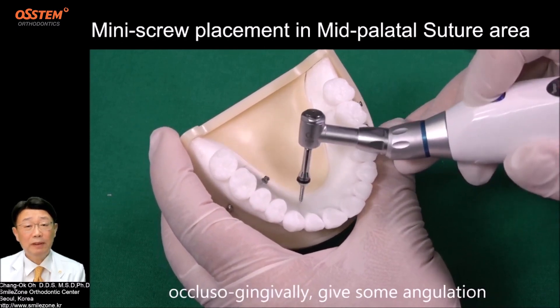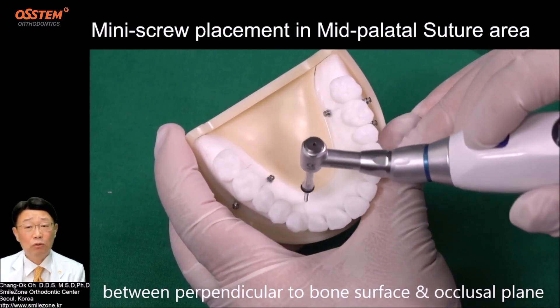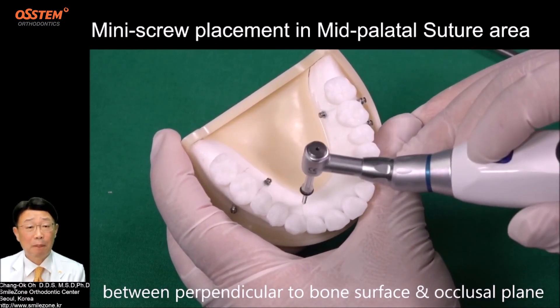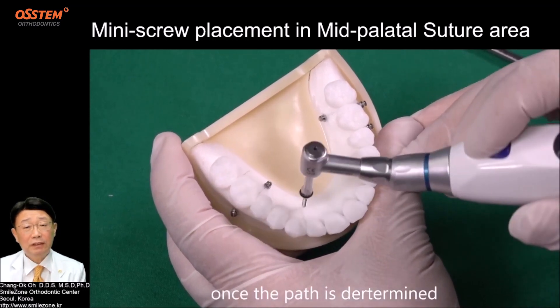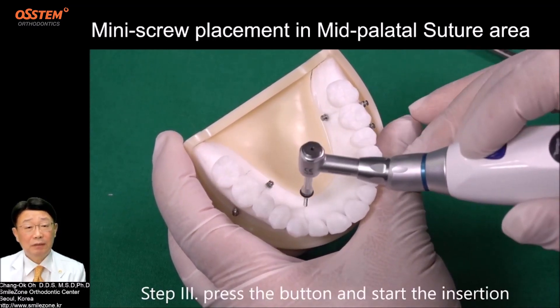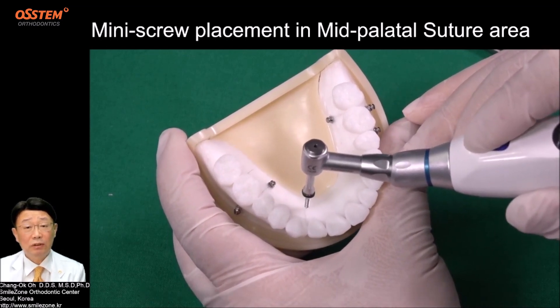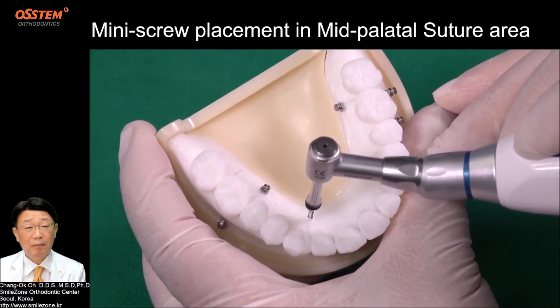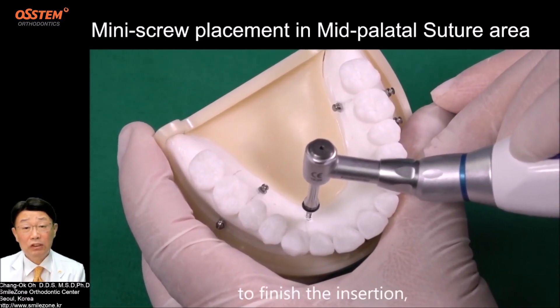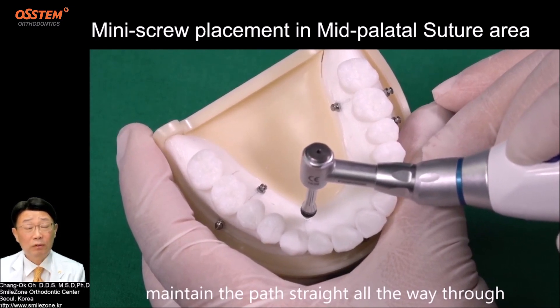The angulation is between perpendicular to the bone surface and the occlusal plane. Once the path is determined, Step 3: press the button and start the insertion with clockwise rotation. To finish the insertion, maintain the path straight all the way through.